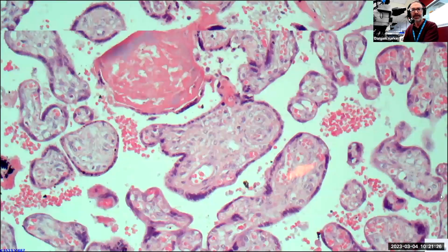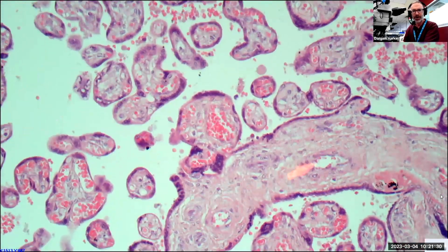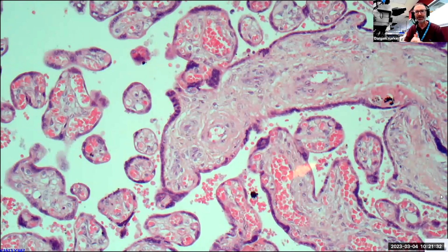The reason this looks like little globs or islands of structures relates to the internal structure of the placental membranes and how the chorion, when it pulls away from the uterus, has these undulating structures. Even the placenta itself has a degree of folding that takes place once you've sampled it, processed it, and put it into a block, so we get this island-like arrangement.